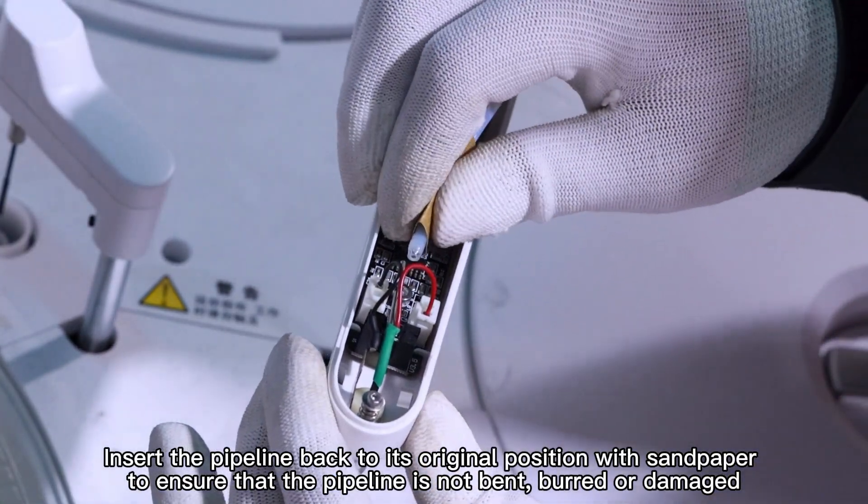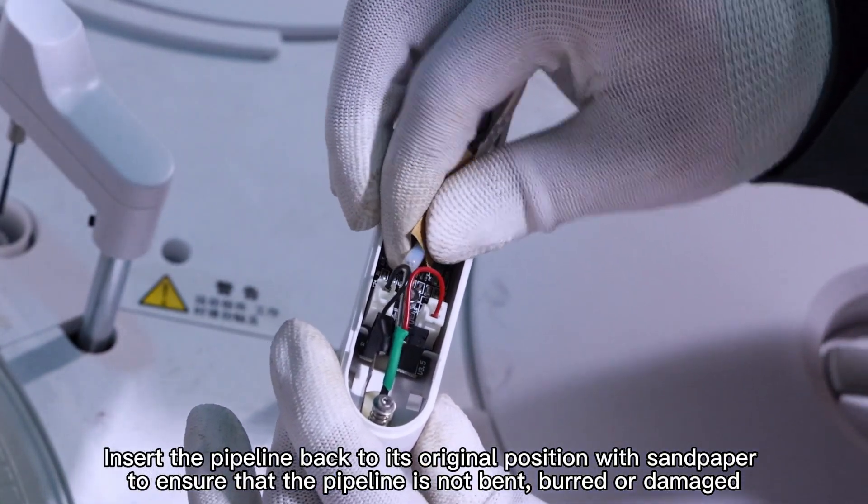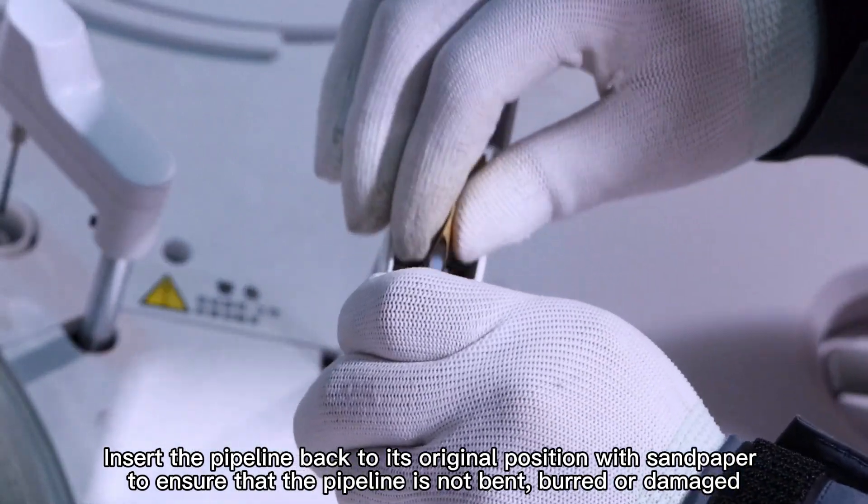Insert the pipeline back to its original position, using sandpaper to ensure that the pipeline is not bent, burred or damaged.